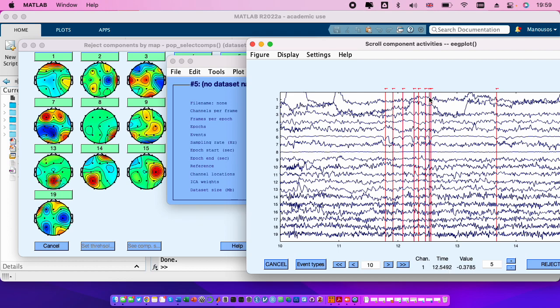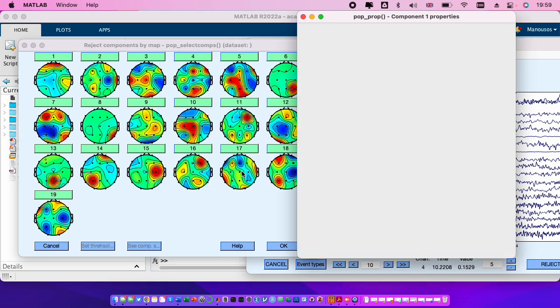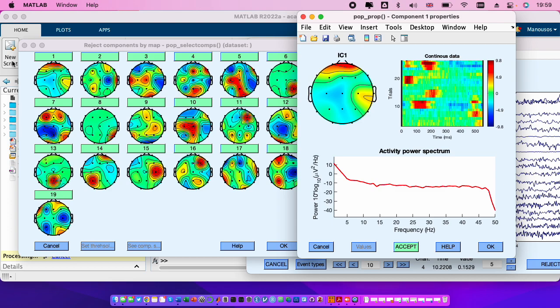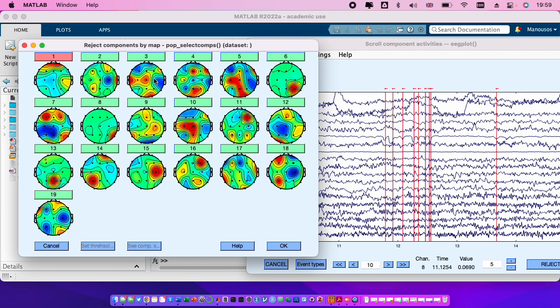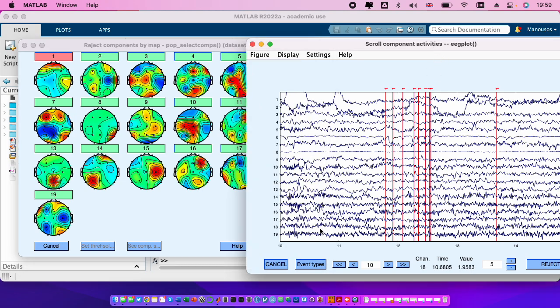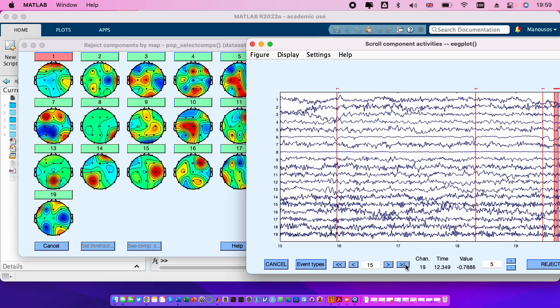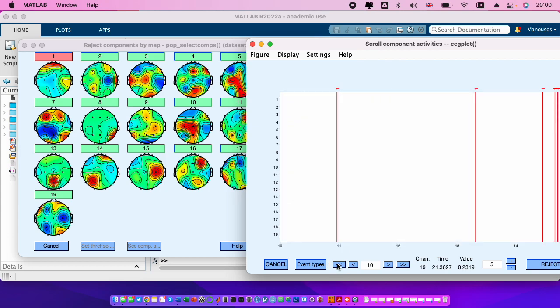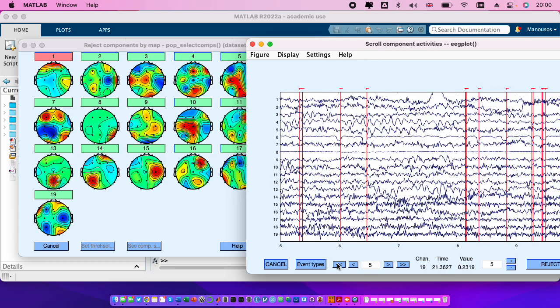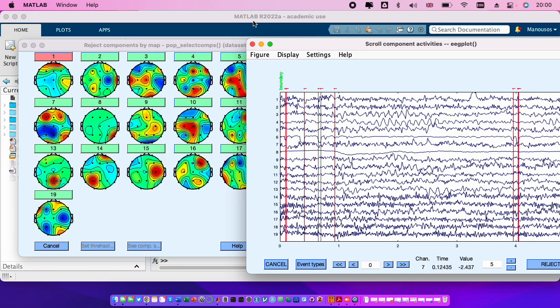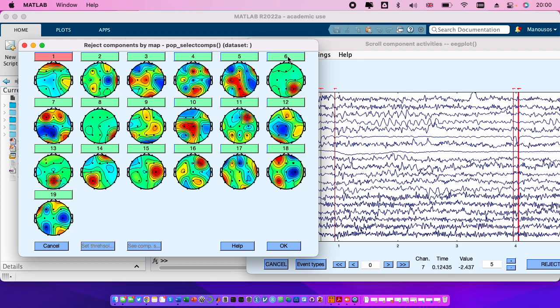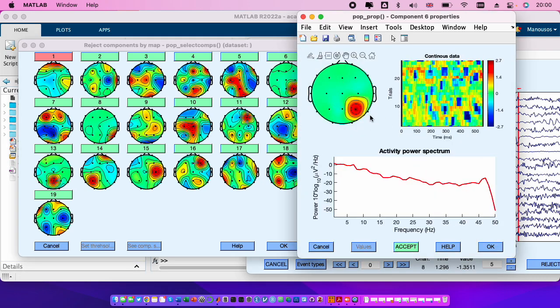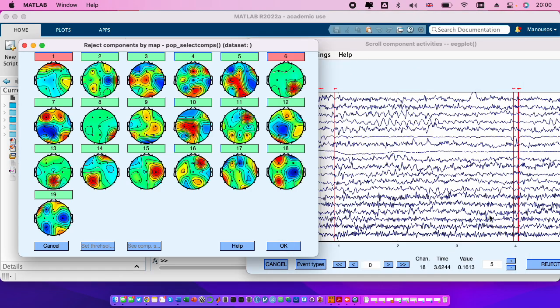Here I tend to press norm in order to see more clear. So the first one, it's obvious that this is the blinks and so on. So the first one is going to be removed. We press the one button here and from accept we turn that to reject and then we press ok. Then let's check the 13th, probably the six here from the activity.